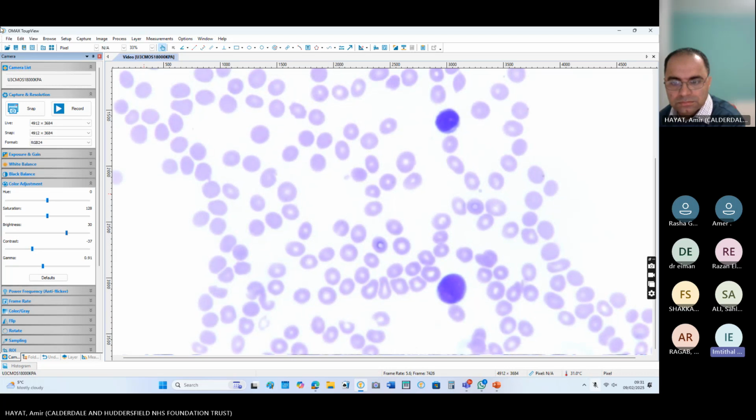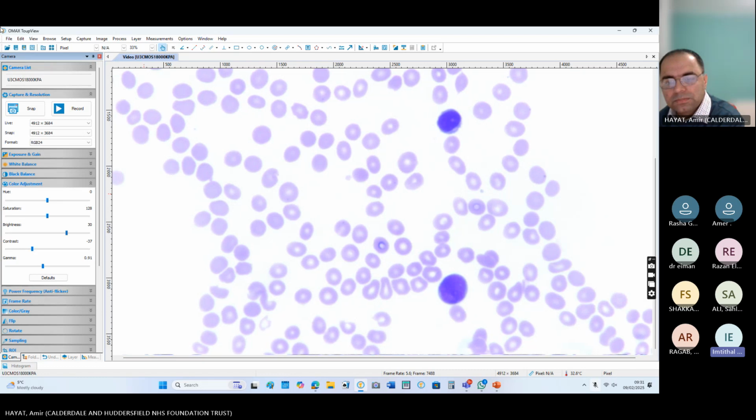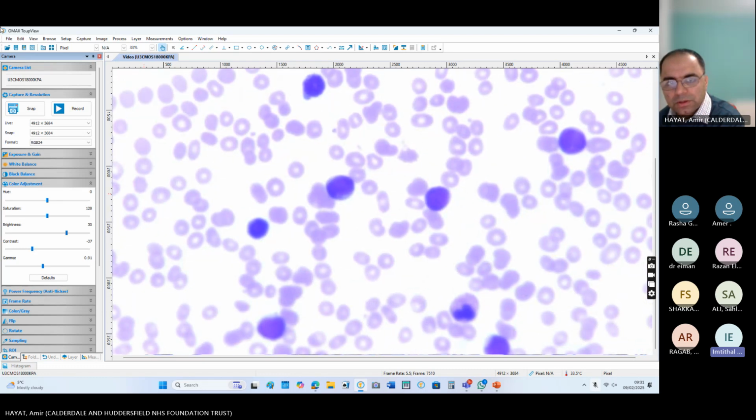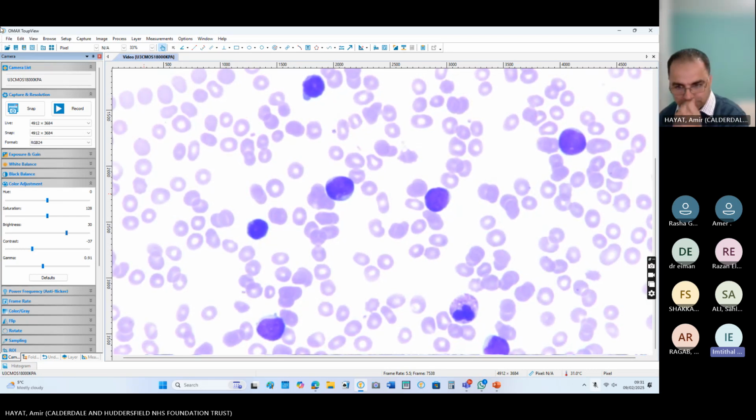Good afternoon. Anyone, did you hear me? Yes, we can hear you. I noticed that there is mild anisocytosis. There is leukocytosis, mainly lymphocytosis with a little bit small lymphocyte with fine chromatin, high NC ratio, and marked thrombocytopenia.